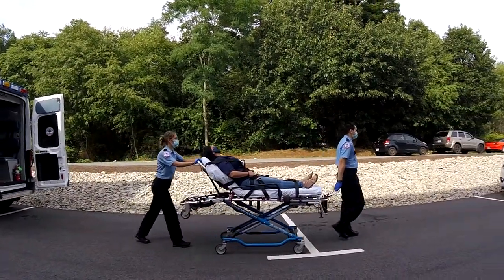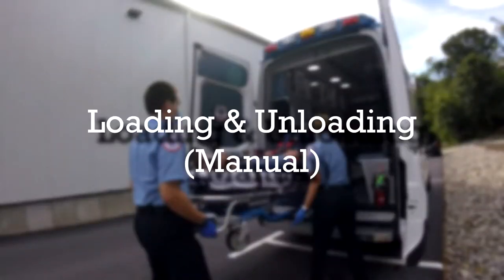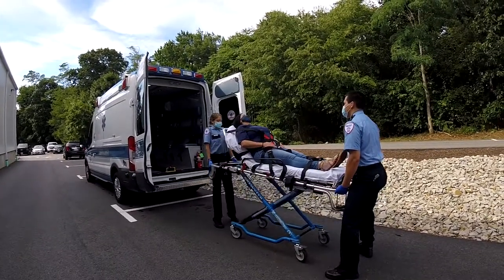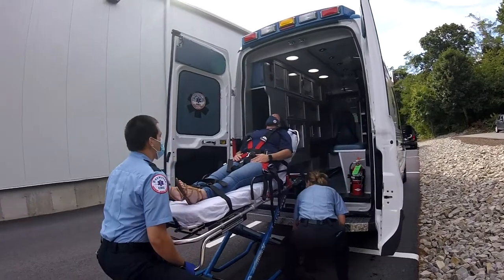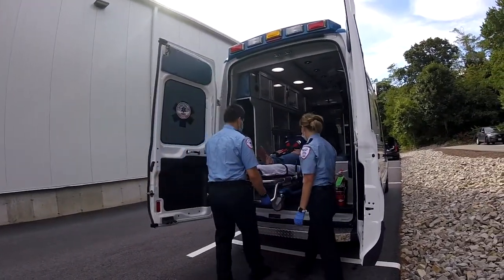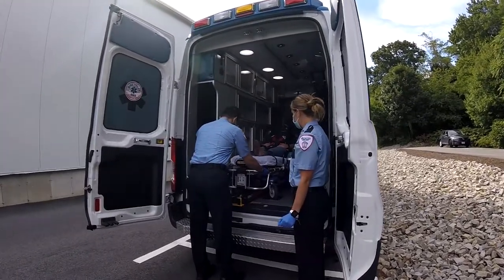Avoid rough terrain or slopes when moving the patient on the stretcher. When loading a manual stretcher, it is important to use proper lifting technique in order to avoid injury. The team member lifting the legs of the stretcher should ensure that the stretcher has been fully lifted and the pressure has been released from the legs prior to pushing the legs up. This ensures that a stretcher tip will not occur — you will hear the release of pressure by a click on the stretcher.